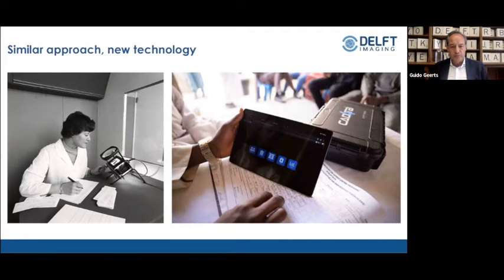into information. So with this kind of techniques, you can also have, for example, 10 locations with CAD for TB in remote areas, and you can centralize this to one cloud solution where you can have a collective information of the total project you're trying to establish. And that kind of information you can do on instant. And that is something that gives a lot of extra value.